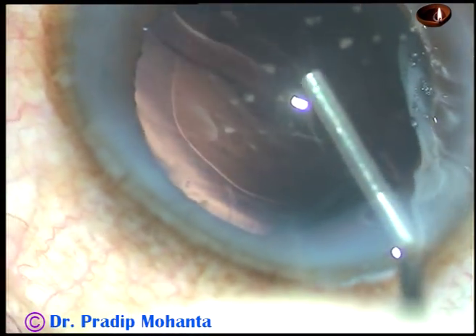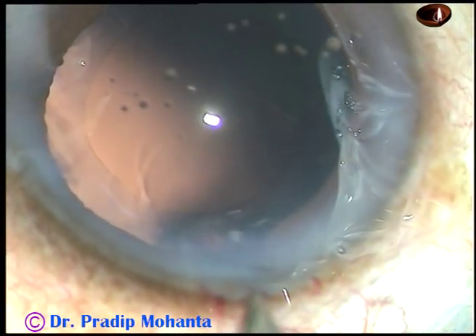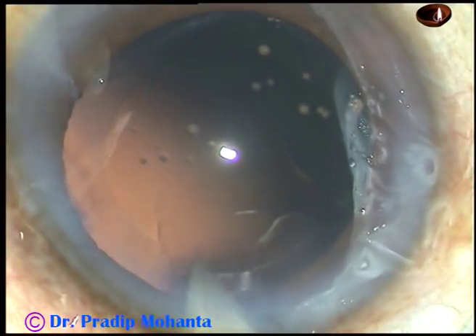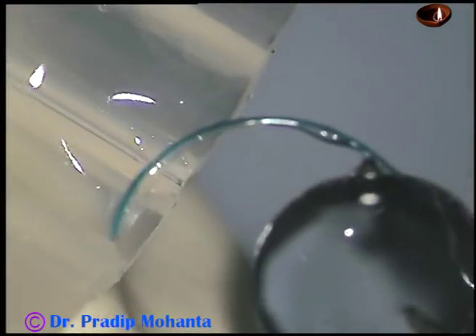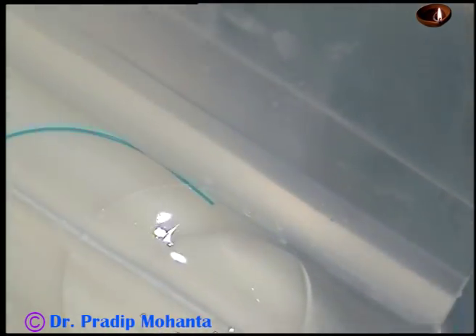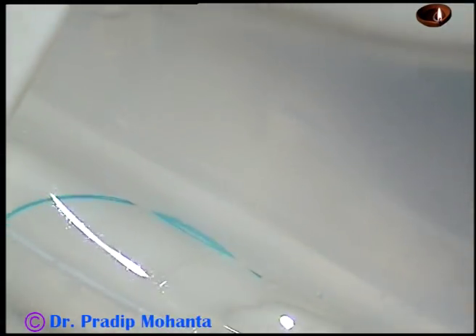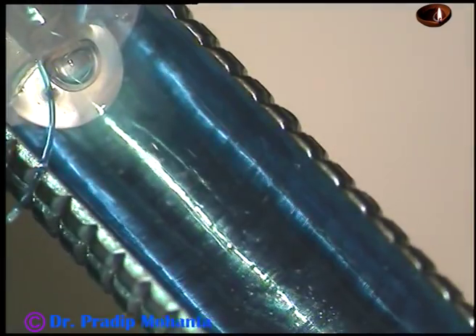Now inject viscoelastic substance. In this case we have selected a Sensar multi-piece intraocular lens. In such cases, enlarge the main incision a little bit — the main incision which was 2.8 mm has been enlarged to about 3 mm. Now to load the lens: hold the lens with McPherson's forceps, go from behind, and the optic should be in the groove. The overhanging edges should be in front of the periphery of the optic on both sides. Fold the flaps and ensure that the trailing haptic is not in the groove — it should be on the left side. Then advance the plunger.